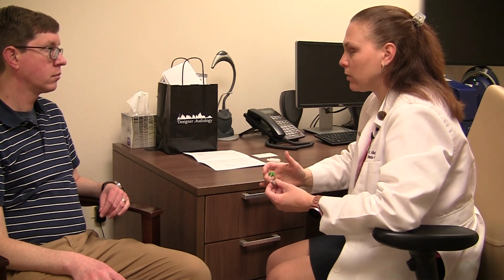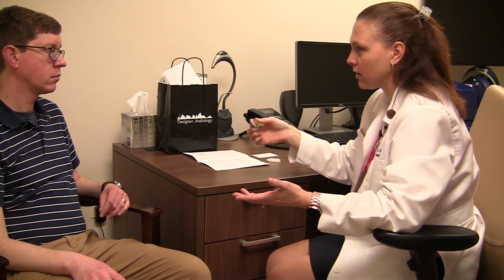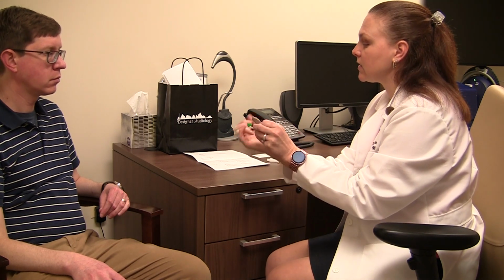So next part I want to talk about is how do you know the right from the left? You're going to get really good at looking at it and knowing this is your right ear, this is your left ear, just by the shape of the device that goes in your ear. However, if you need a little help, on the very bottom of the hearing aid, it's pretty small so nobody else sees it, you can see there's a little red mark to tell you it goes in the right ear. Red right, RR. The left ear has a blue mark. I don't know how to remember left and blue, but if you remember red and right, you've only got one other ear.